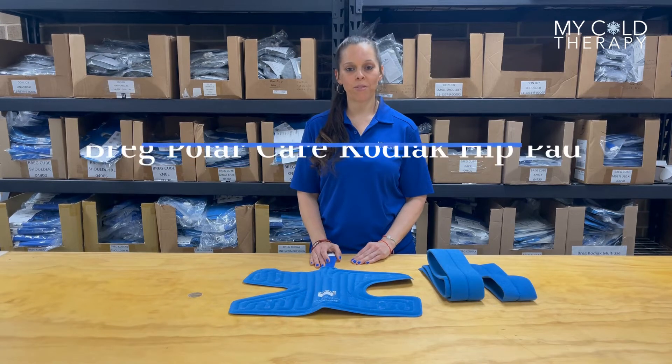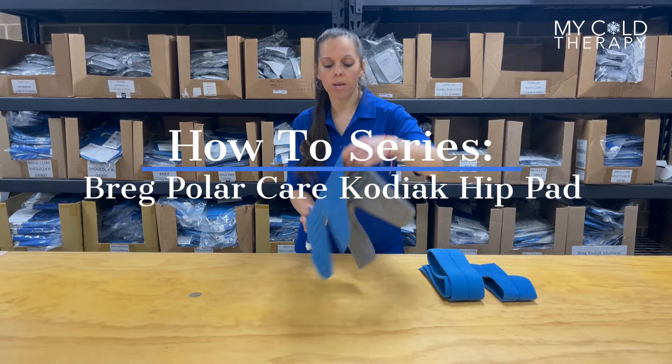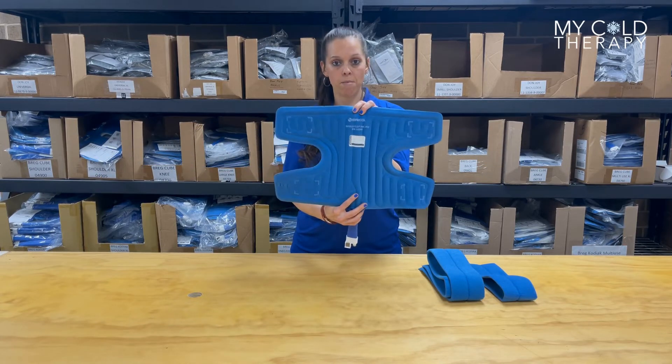Hey guys, Michelle here from MyColdTherapy, and today we're going to demonstrate how to apply the Bregg PolarCare Kodiak Hip Pad.